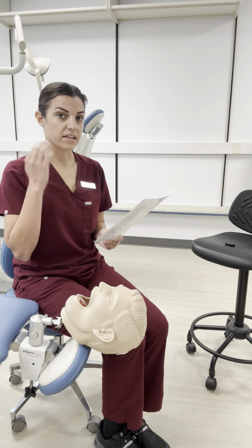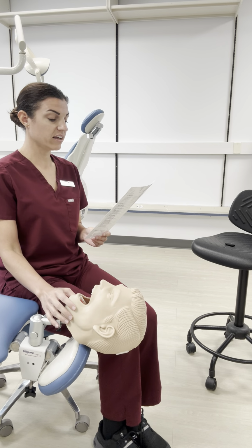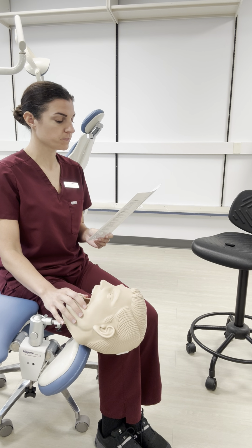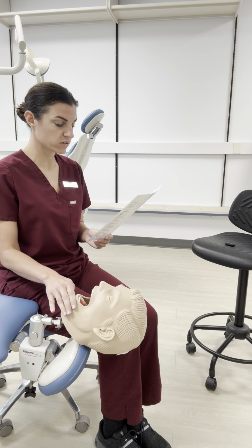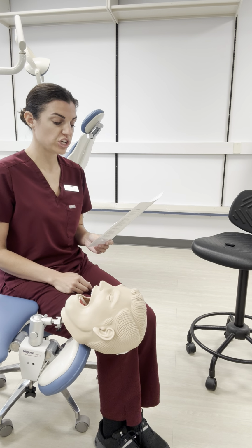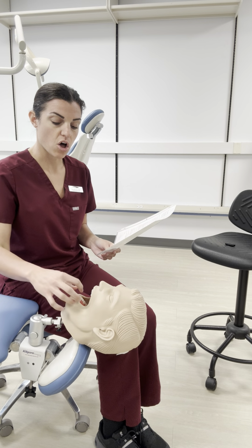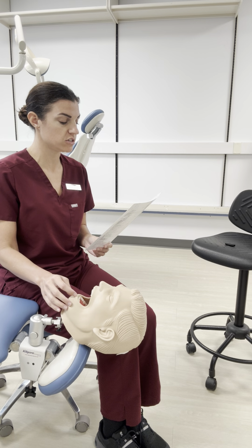Mandibular right buccal, so that's on the bottom. We're going to be again at 8 o'clock here, chin down, because we're working on mandibular, and neutral. Mandibular anterior labial surfaces towards, we'll be at 8 o'clock, chin down, neutral. Those are all of the facial surfaces on the mandible that are closest to you. You'll be at this 8 o'clock position.